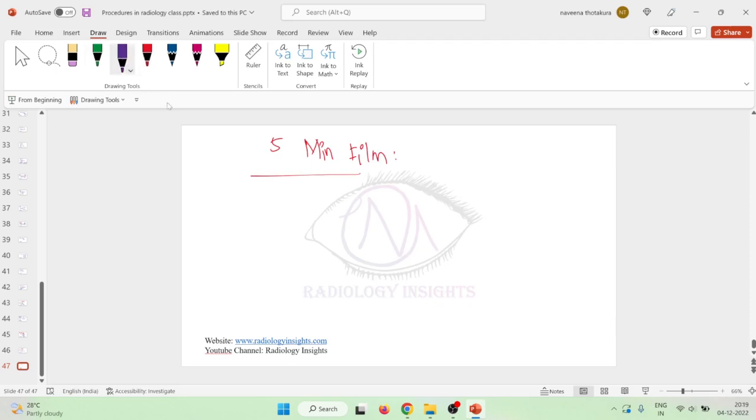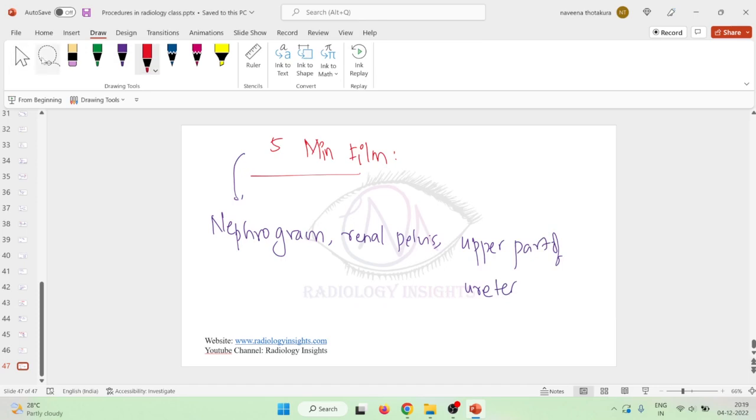In this 5 minute film, we will see the nephrogram. It will show the nephrogram, the renal pelvis, and also the upper part of the ureter. So in this 5 minutes, this will show the complete kidney border clearly. It will show the nephrogram, it will go into the renal pelvis, and also into the upper ureter.